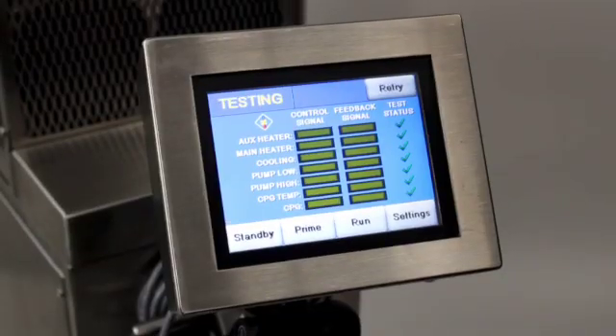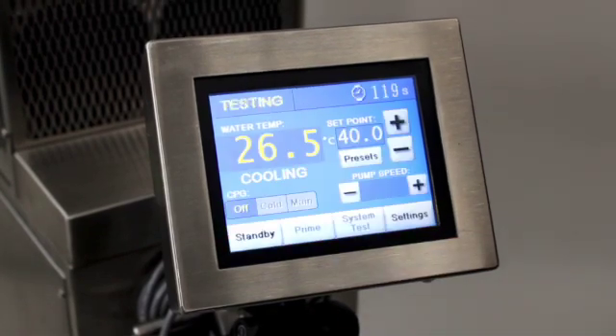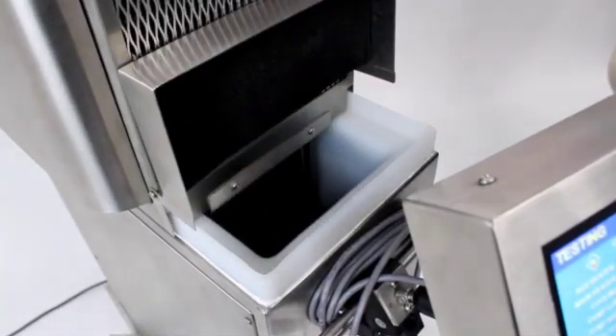To clear the air from the water circuit, press the Prime button here. Once the prime cycle is complete, top off the cold water tank with sterile water.